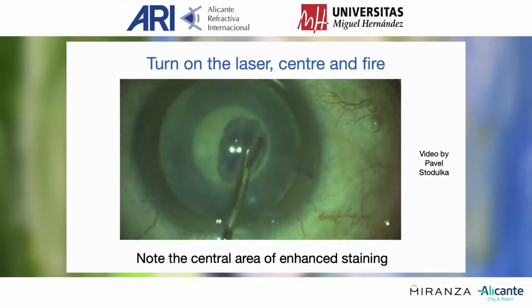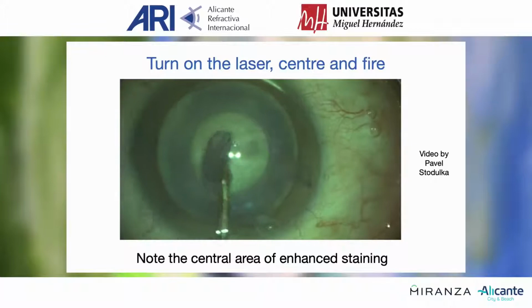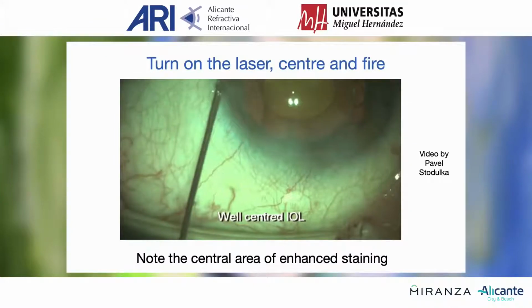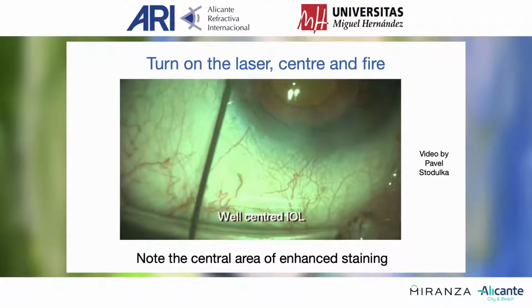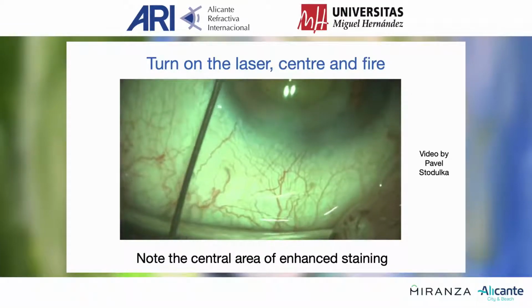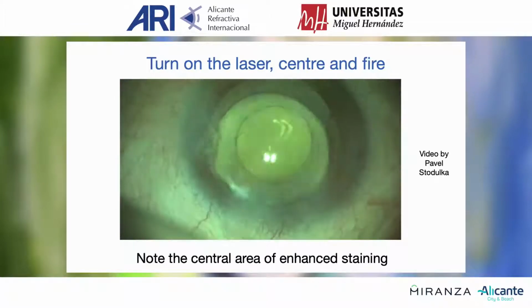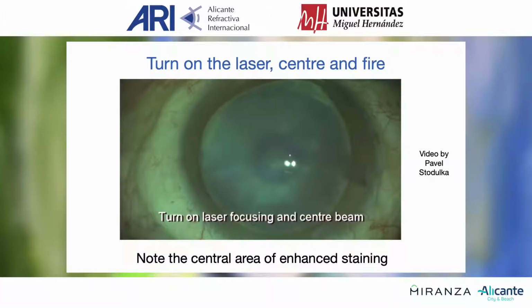This is again a video from Pavel Stodulka, and he's just removing the capsular cap. You can see that the soft lens matter has been kept at bay. The procedure is now at an end, and the capsulotomy is well centered with good 360-degree coverage of the IOL.